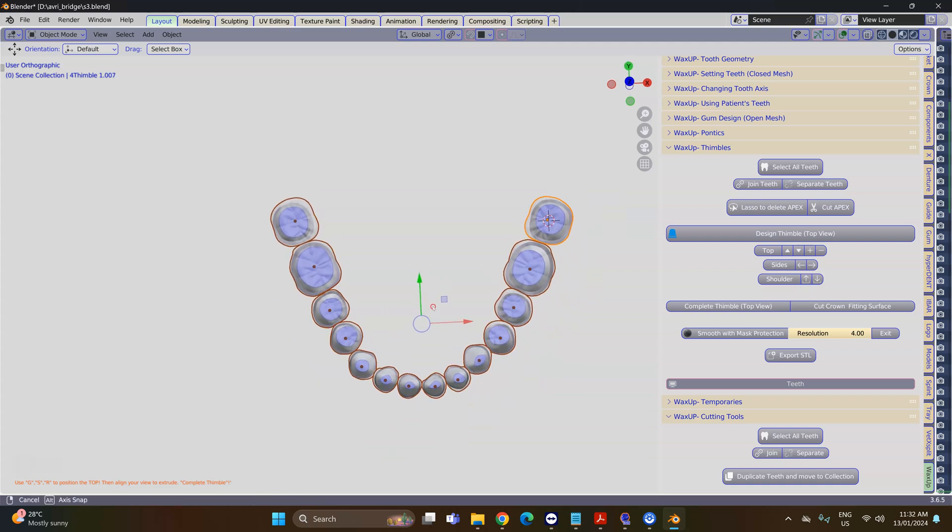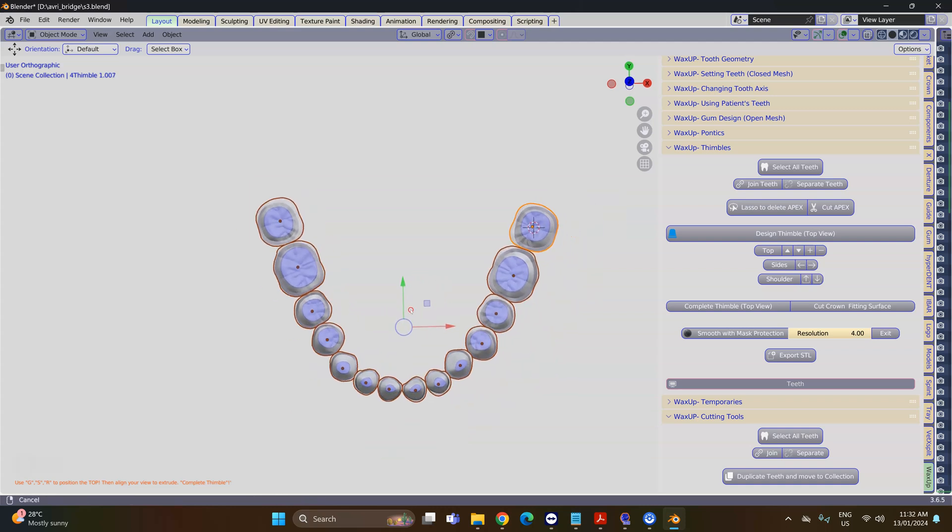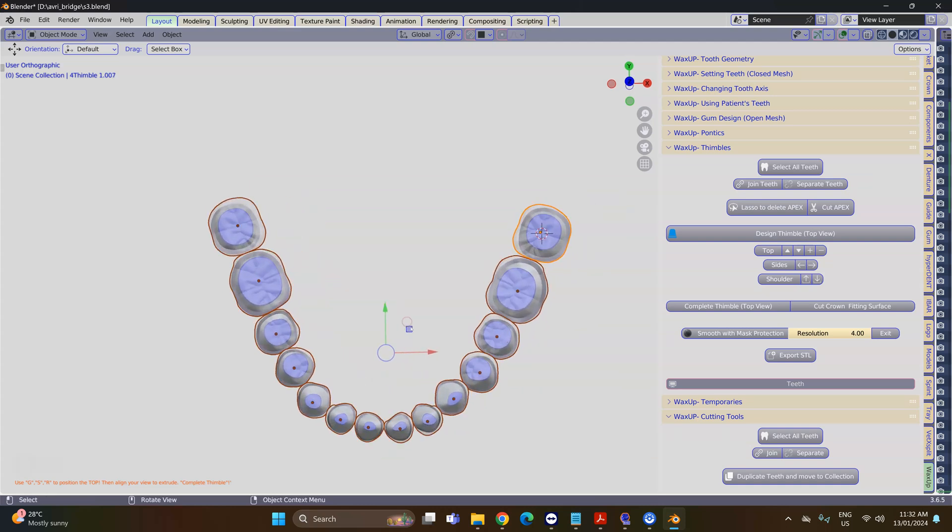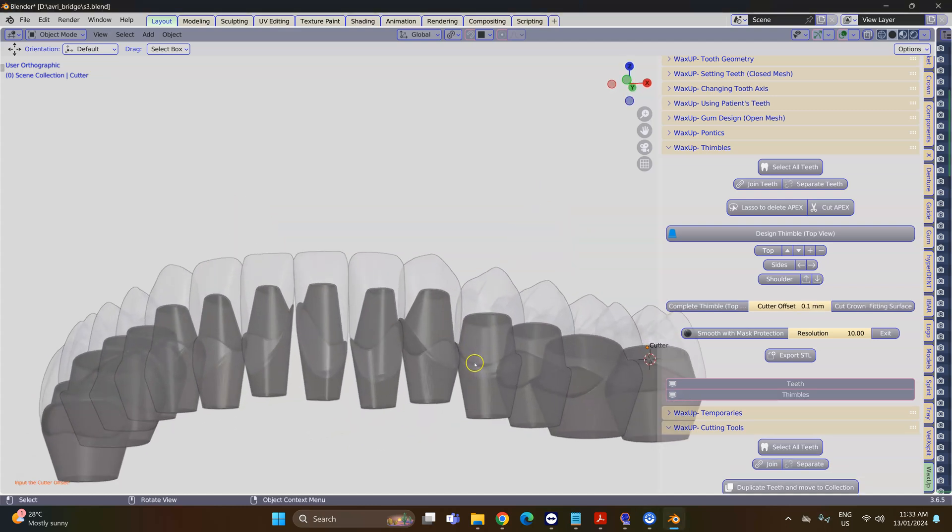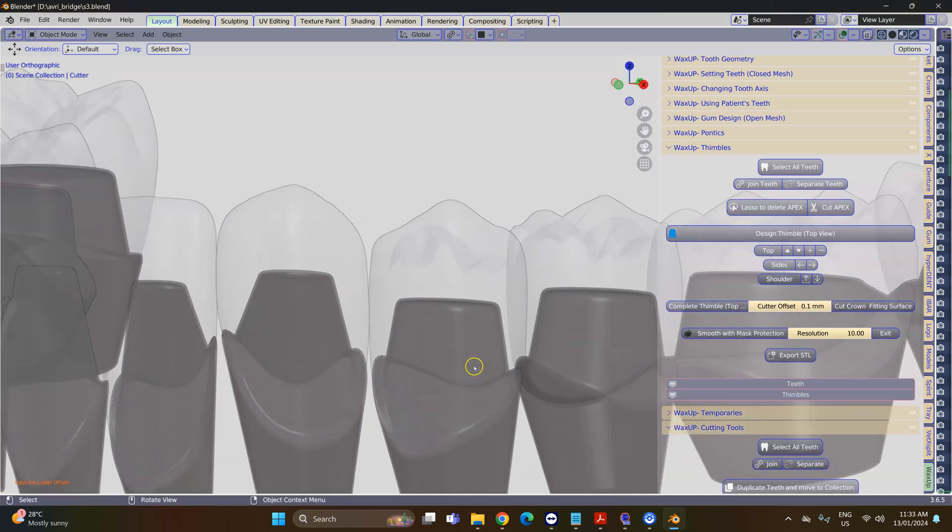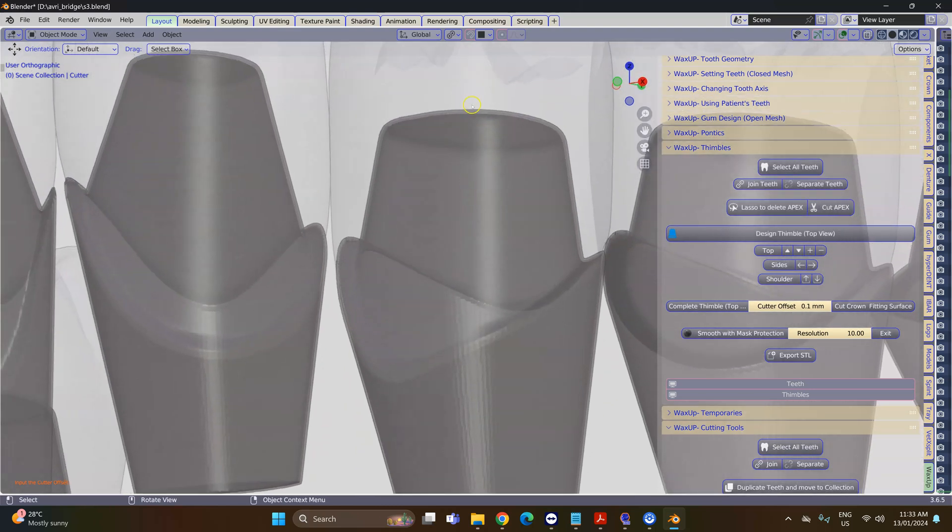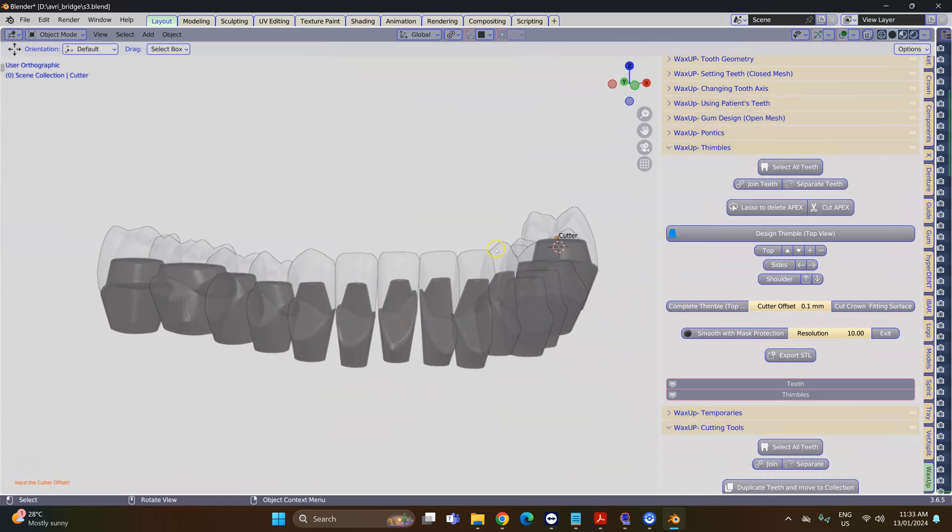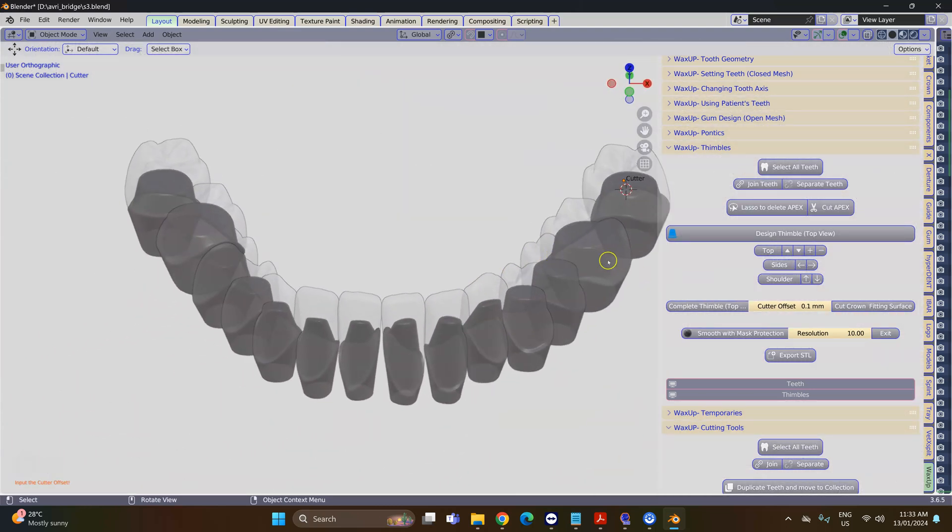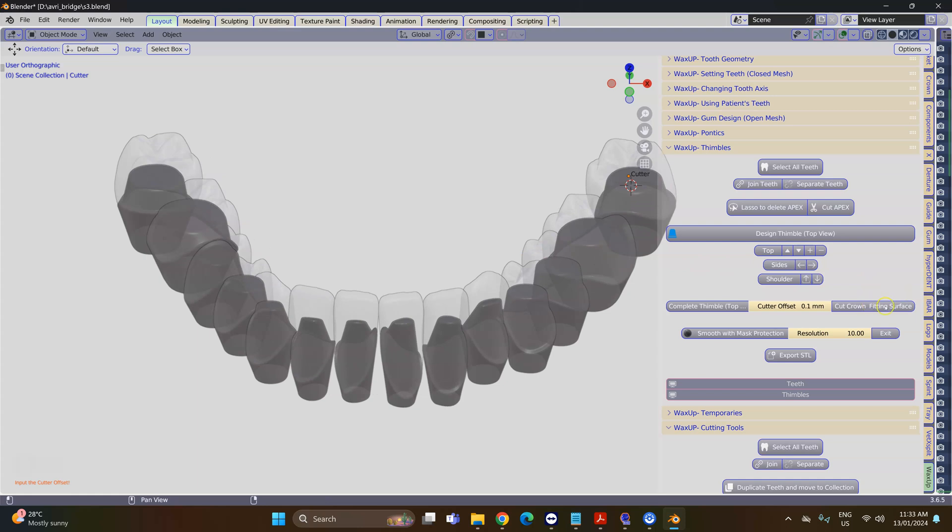Then we're going to complete the thimbles. It says top view. Wait for it to calculate—there's quite a lot of work that's been doing behind the scene. All right, these are your thimbles. They are slightly offset at 0.1. You can change this offset if you like.